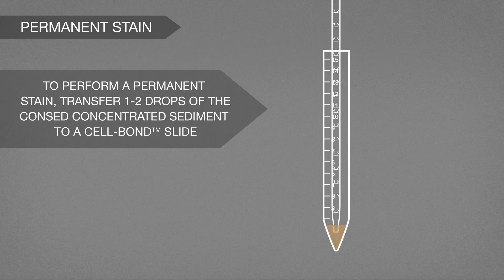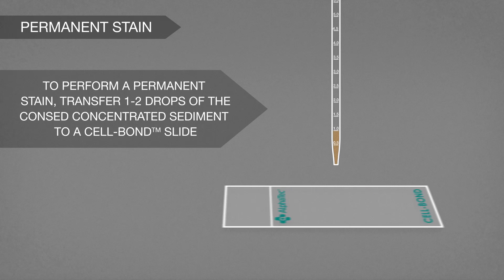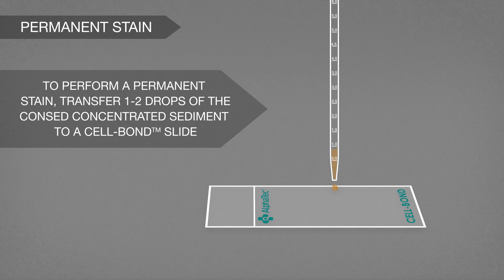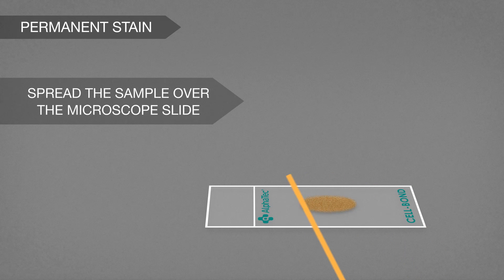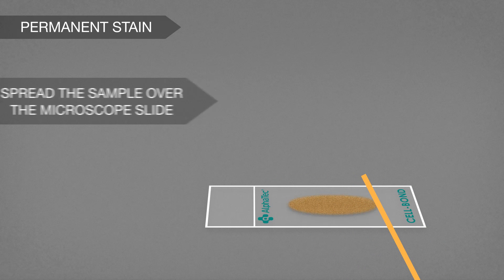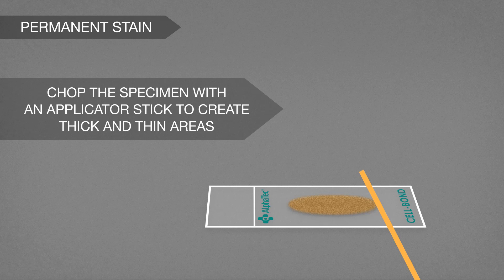To perform a permanent stain, transfer one to two drops of the CONSED concentrated sediment to a cell bond slide. Spread the sample over the microscope slide. Using an applicator stick, chop the specimen, spreading it out. This will create thick and thin areas.